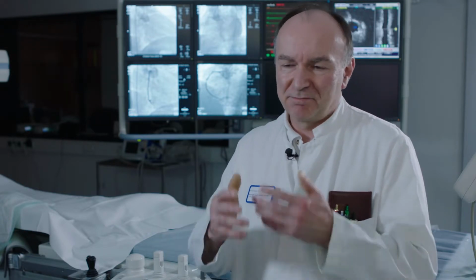It's a technical part and a psychological part, or a mindset. The operator who goes into a CTO procedure needs to be not under any logistic pressure, because, as we mentioned before, a CTO is not planned in its time requirements. You know, there are easy and there are more difficult CTOs. So you need to be under no pressure going into the procedure. But it's important to have a pre-formed plan. What is my primary approach? What is the secondary, tertiary, or quaternary approach?